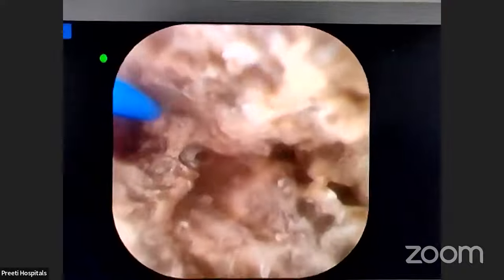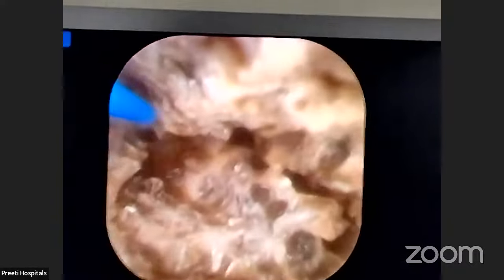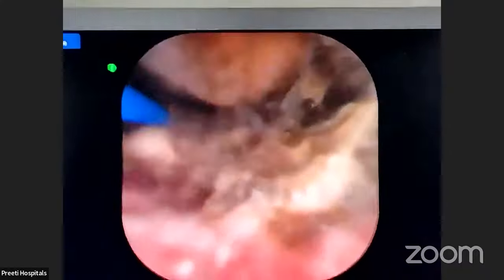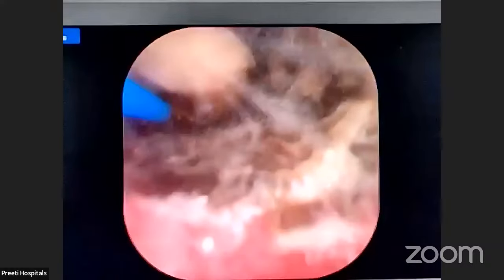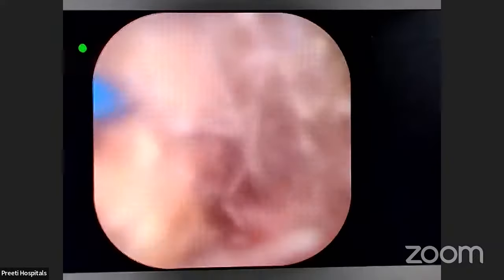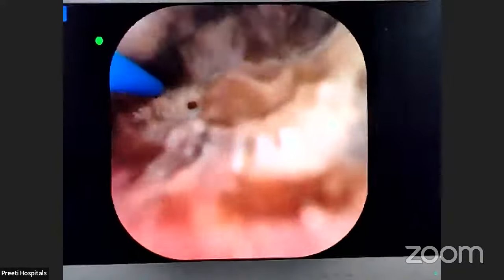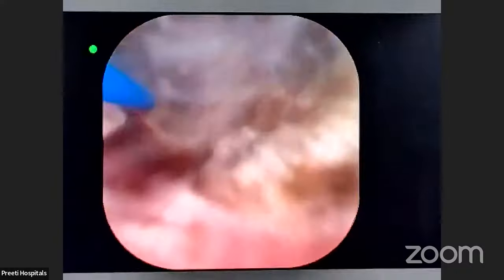For example, if I break here the stone like pneumatic, it will go into calyx. It's a dilated calyx. So I will be going like, see, these are all fragments. See, this is a fragment. This big fragment will not come out. Let you trap it and pulverize there only. See, continuously it is flushing water. That is a disadvantage. You can use the irrigation, normal gravity irrigation. Now make it 1.5, or this also okay.